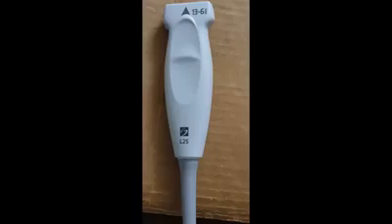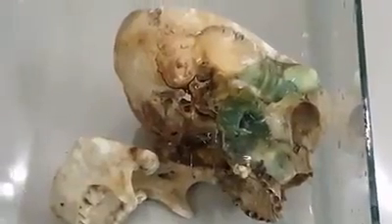For ultrasound guided sphenopalatine ganglion block, it is preferable to use a high frequency linear probe with a shorter footprint like the one shown. In this video, I will be demonstrating how to do sphenopalatine ganglion block under ultrasound in a skull.